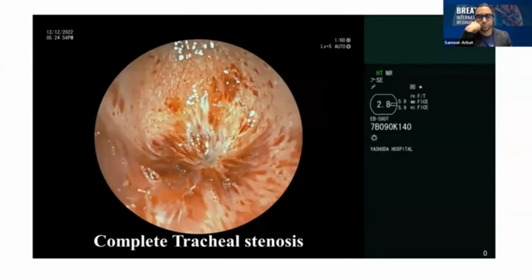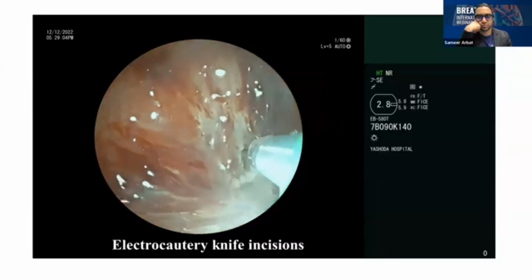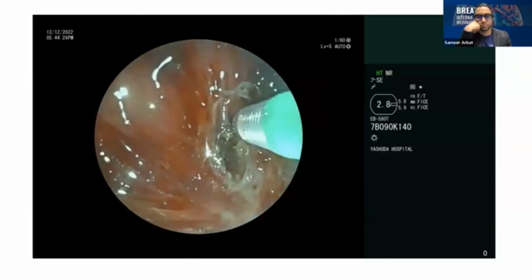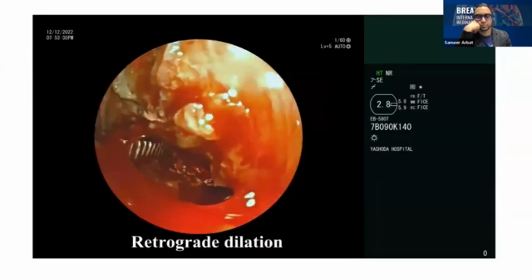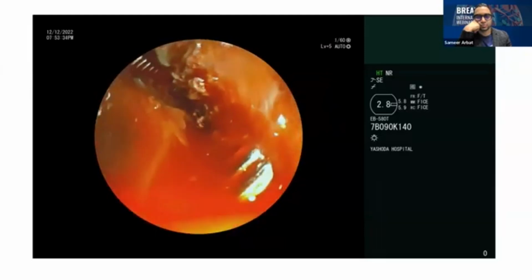This was selected as one of the best videos in the Bali World Congress of Bronchology and Interventional Pulmonology. And this is an extremely challenging case. So what I'm doing is initially I'm making the electrosurgical incisions with the help of an electrosurgical knife. Then I'm using a CRE balloon and I'm creating a track. And we are doing something called a retrograde dilation to open up the airway.